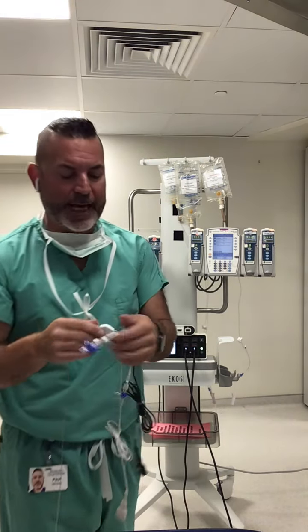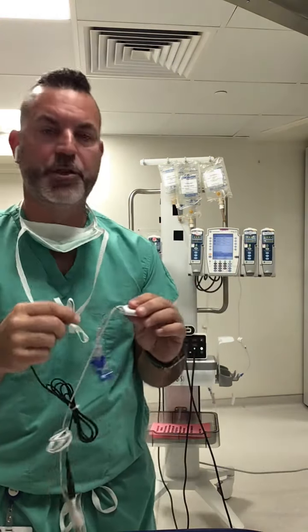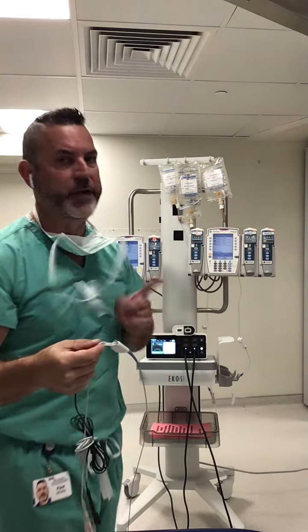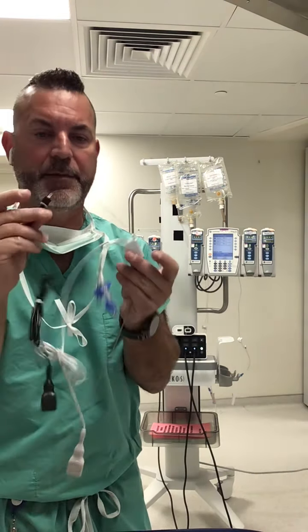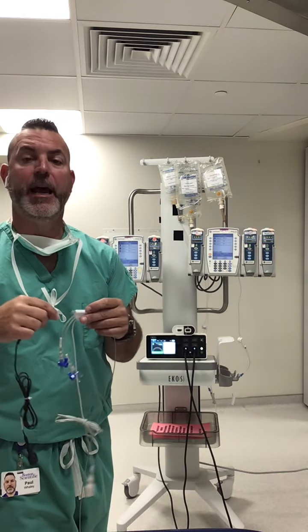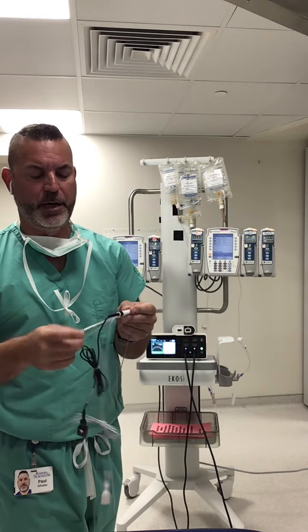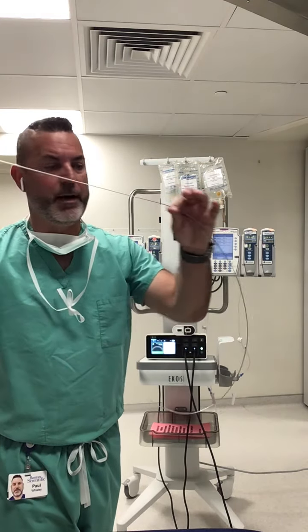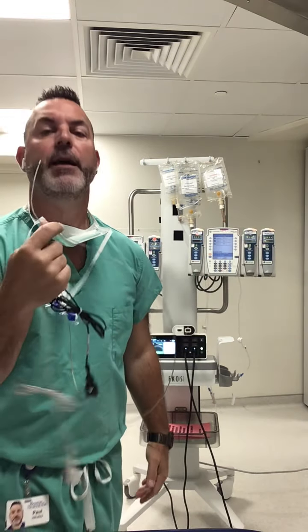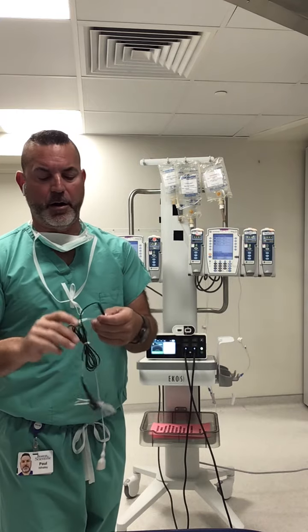The coolant actually cools off my ultrasound wire that's inside the catheter. Ultrasound at 2.2 megahertz, which is generated from this machine, you'll never be tested. Just know ultrasound that comes out of a metal wire creates warmth. We need to cool off our ultrasound wire, and that's what the normal saline does. The normal saline flows from my coolant port, bathes my ultrasound wire all the way out, and then literally comes out the tip of this catheter just like an IV in the patient's vasculature. That's the only purpose. Let's talk about our drug port.